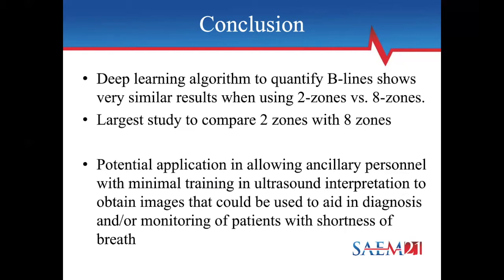Another strong point of the study is the utilization of AI. This has potential application in allowing ancillary personnel with minimal training in ultrasound interpretation to obtain images that could be used to aid in diagnosis or monitoring of patients with shortness of breath.